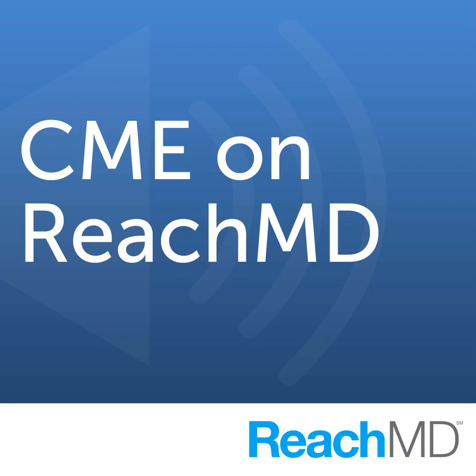In order to conclude, I would like to stress again, echocardiography with provocative maneuvers is recommended in all patients with HCM to detect LVOT obstruction, even if they're asymptomatic. Exercise stress echocardiography is recommended in every symptomatic patient. And if we need detailed LVOT assessment and anatomy of the septum prior to septal reduction therapies, then TOE, CMR, and CT come into play in the precise assessment of both the septal hypertrophy and mitral valve apparatus.